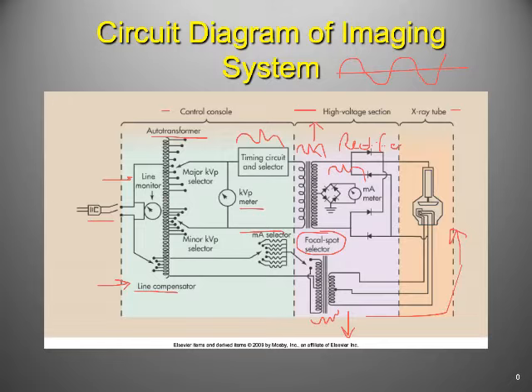So essentially what it's doing is it's getting rid of the sections down here, right? That'd be one level of rectification. If we go to the next level of rectification, it then flips it over the line, right? We could even further rectify it to where it's producing something more like this, where it has things in pulses or in sequences. Okay, so we're going to look at that in just a second, but I want you to be aware that's what this guy is doing right here, the rectification.